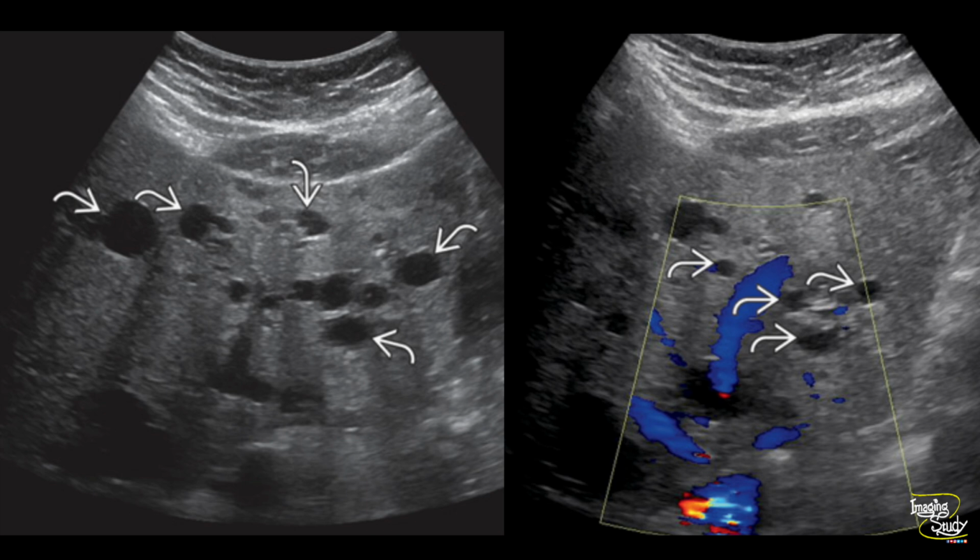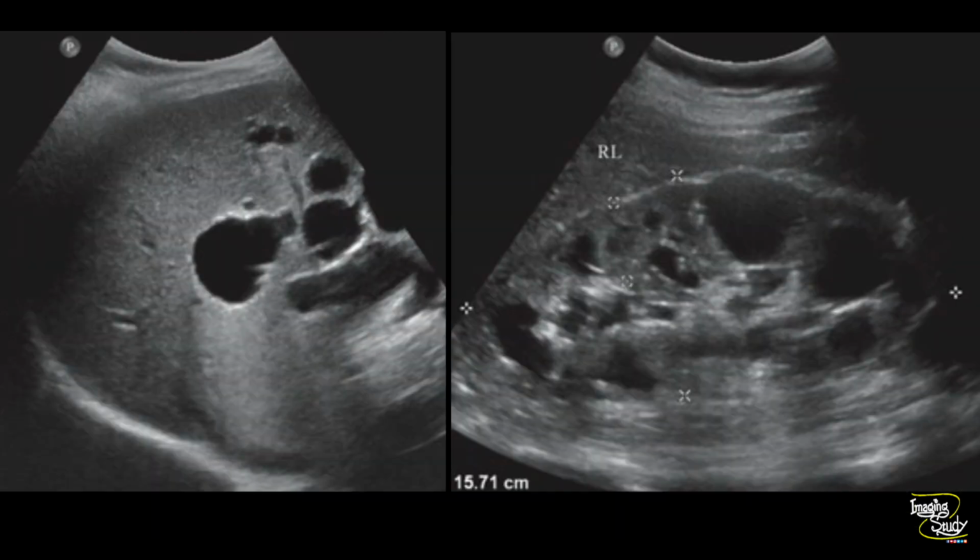Here's the picture of the liver showing innumerable cystic lesions throughout the liver parenchyma in a patient with polycystic liver disease. On the right image, you can see no internal flow on color Doppler. Here's another picture with an autosomal dominant polycystic liver and kidney disease showing multiple cystic structures of variable shape and size within the liver parenchyma, and the kidney is also enlarged with multiple cystic lesions within, which is a common association.